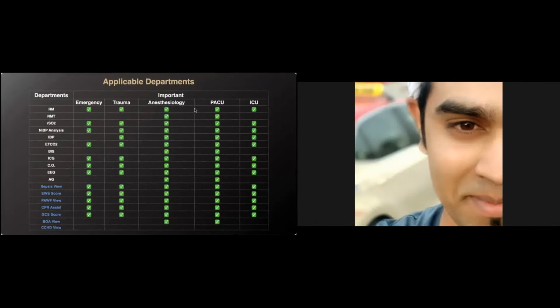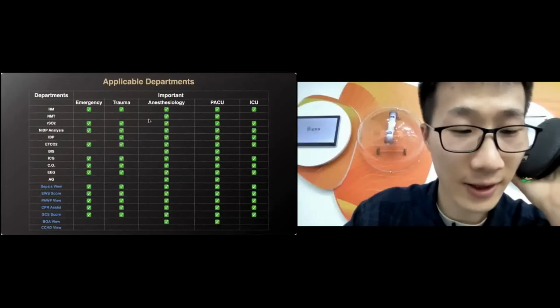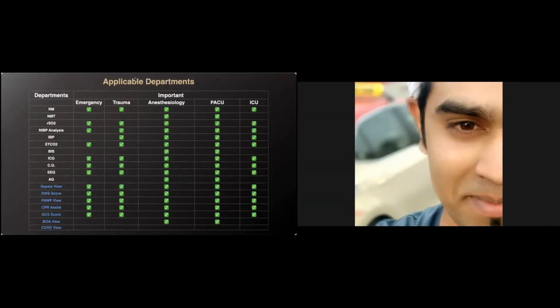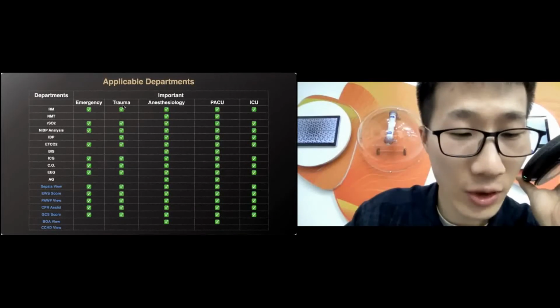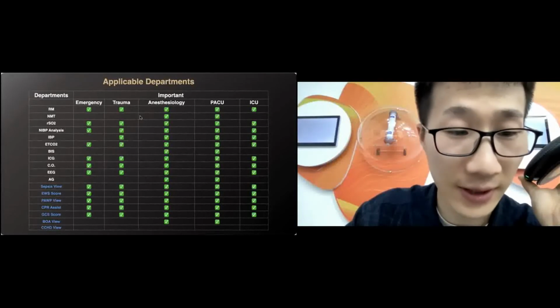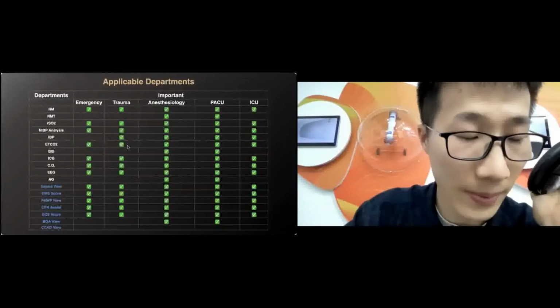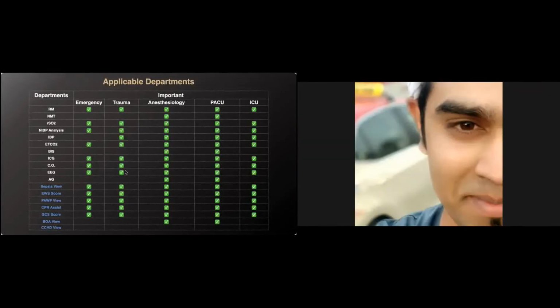I just have a question regarding the P series of the monitor. Do we have an integrated PC along with this series? Integrated PC? I think integrated PC is the CMS, right? The central monitoring system, right? No, external display, or no, in the monitor itself, do you have an integrated PC where I can see the PACS view? Our monitor will be able to connect to external displays via DVI. That means we can monitor, but our monitor will not be able to connect to a PC directly. Does this monitor not have an integrated PC? Basically, it's like the Philips MX700 or 800 or 850 series. So we want to just ask.